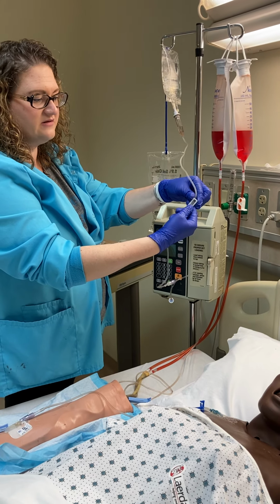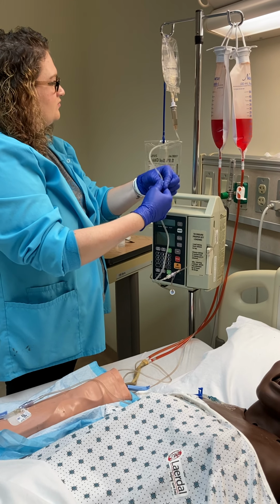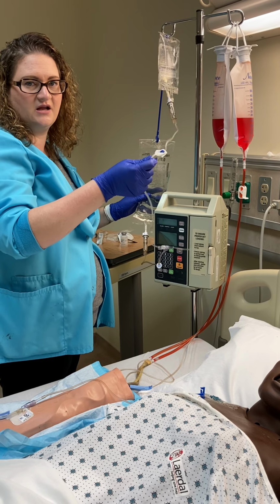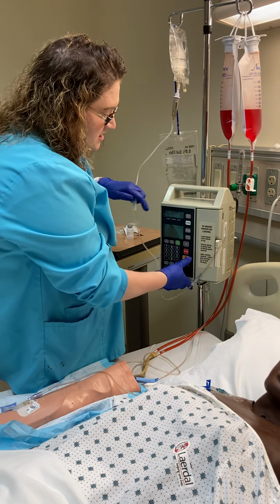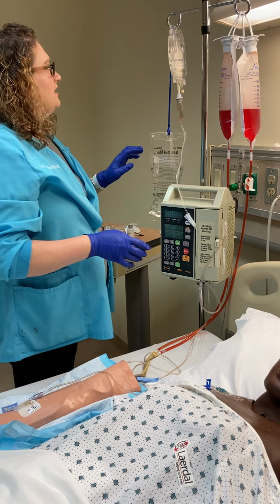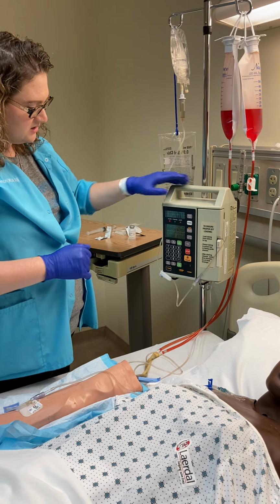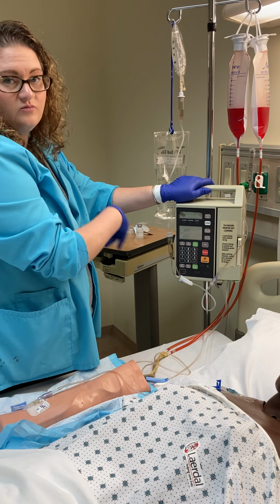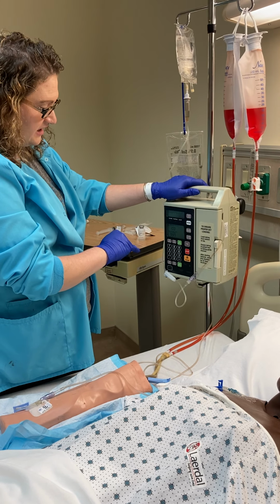I'm going to reopen this clamp because otherwise, if this remains clamped, the primary is going to run and they're not going to get any of their antibiotic. I'm going to turn my pump back on. I still have my primary at 100 mLs per hour and the volume, they'll get 1 liter over 10 hours.